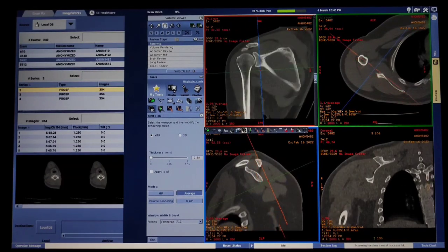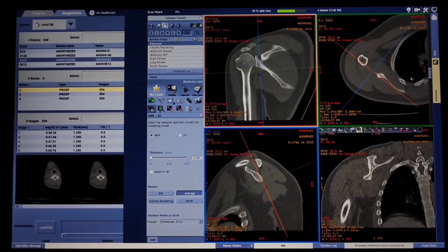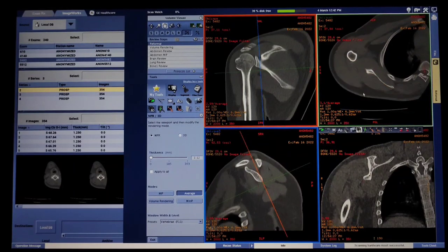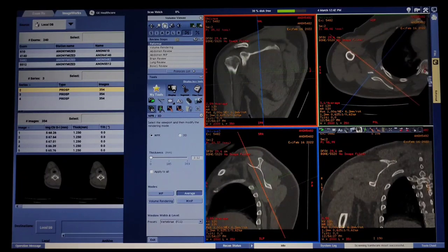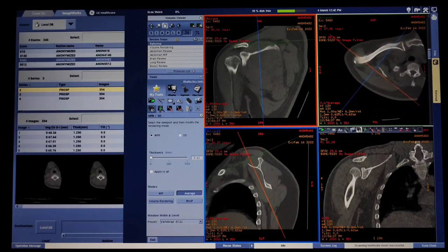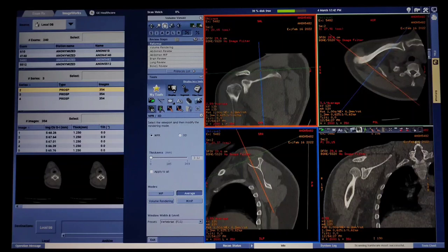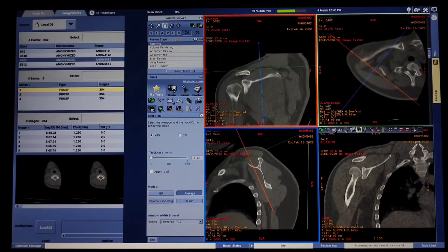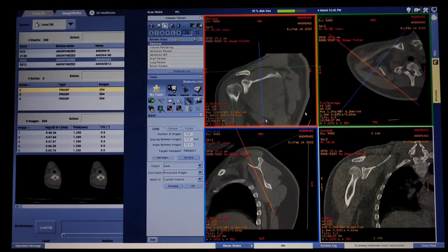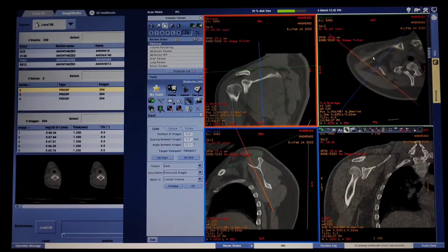Now we can start filming. First of all, we have to make an axial film. We have to scroll down. This is a clavicle — if you want to show a clavicle, you can count the clavicle in the shoulder and we will also cover the clavicle in filming. I will start the batch and start the slice cutting. I will select batch, click the loop, then set and start, then scroll down.